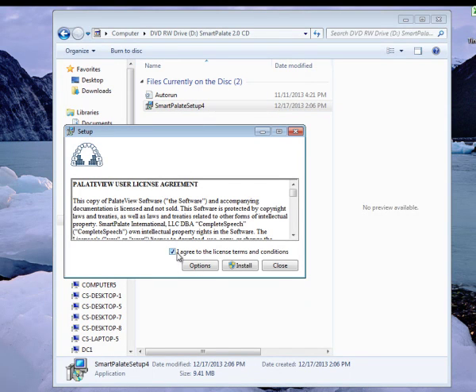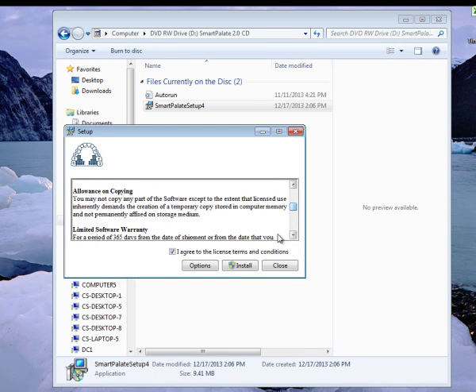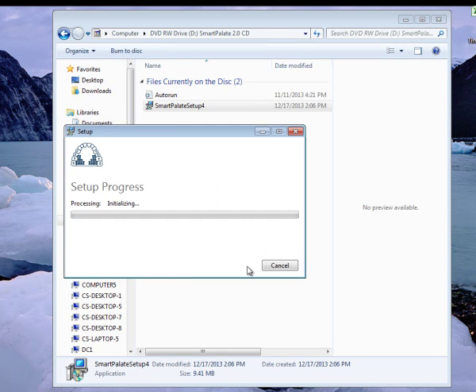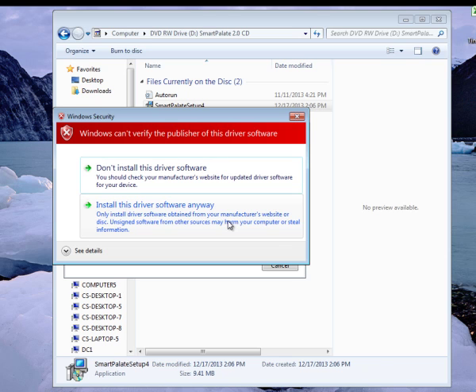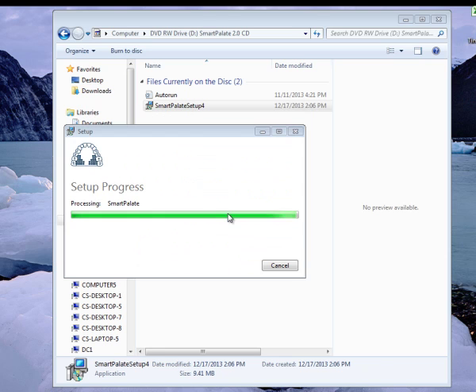Agree to the terms and conditions and click install. During the installation process, make sure you do not have your data link connected via USB port to your computer. When it asks, give permission for the driver to install. Then wait a few more moments for the installation to complete.